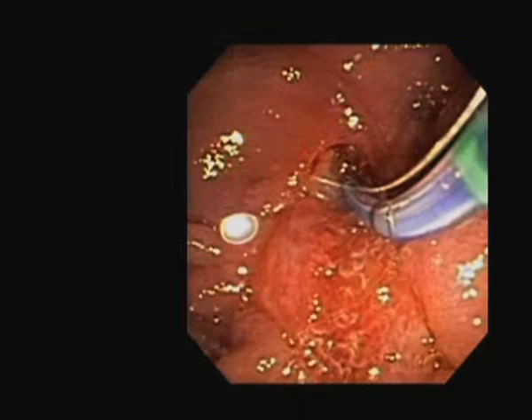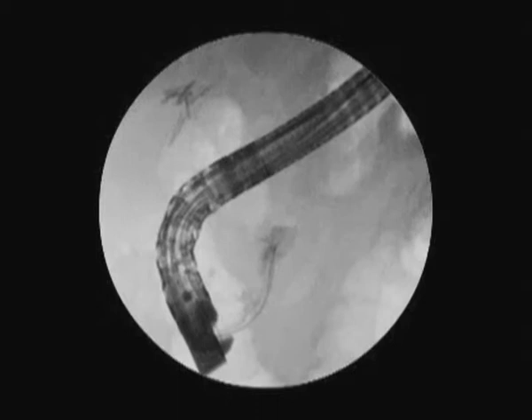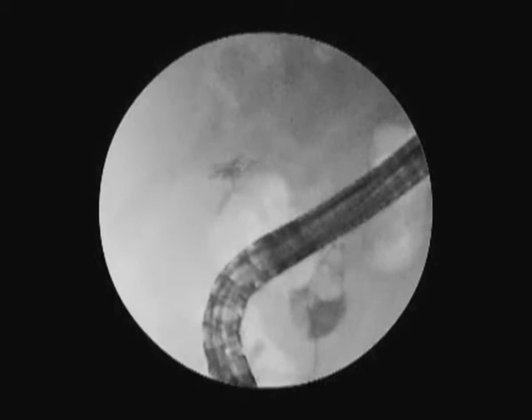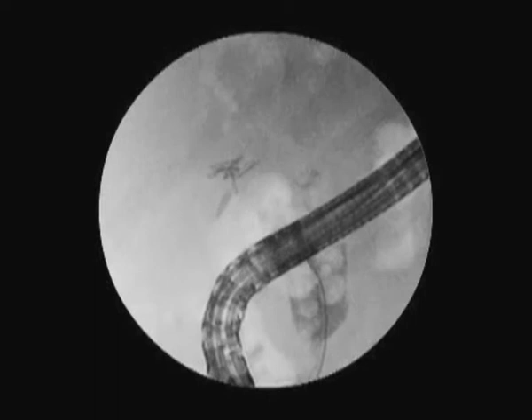It looks like it may need to be enlarged a little bit. Let's inject. So you can see here, this is a very dilated common bile duct. You can see some smaller stones distally, and then just below the scope, we can see that there appears to be a fairly large stone here that's obstructing the distal duct.